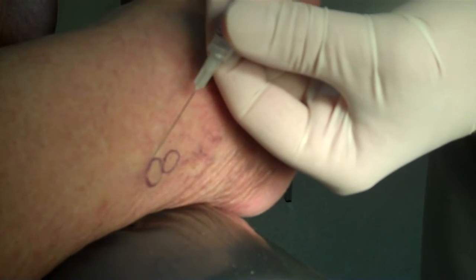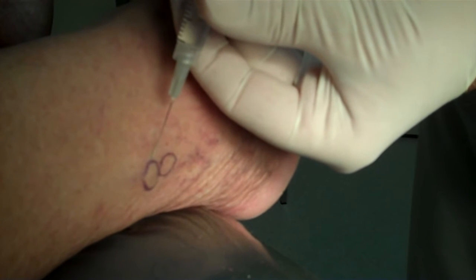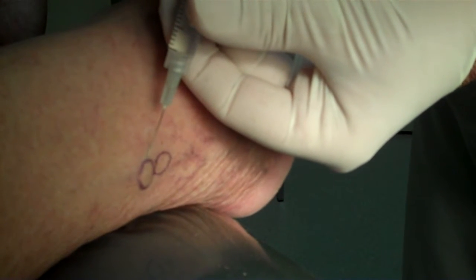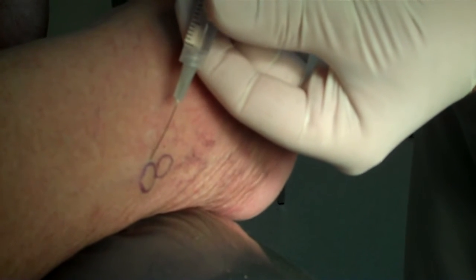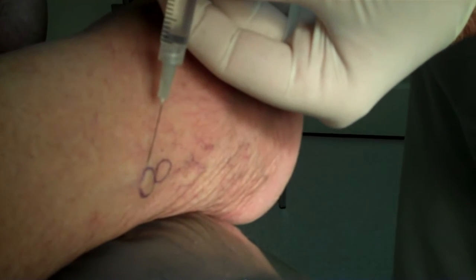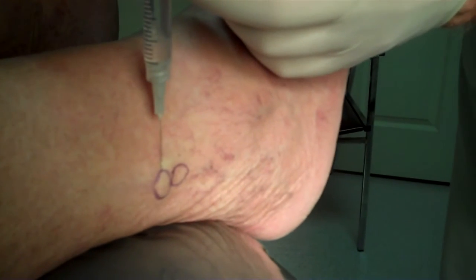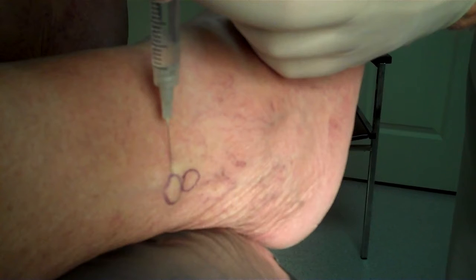While the skin freeze sometimes helps the pain from the needle stick, that skin freeze or ethyl chloride can actually kill some of the nerve cells, so you're going to get an abnormal reading — it's going to make it look worse than it really is if you freeze it. So this is one of the few cases we can't really use skin freeze.